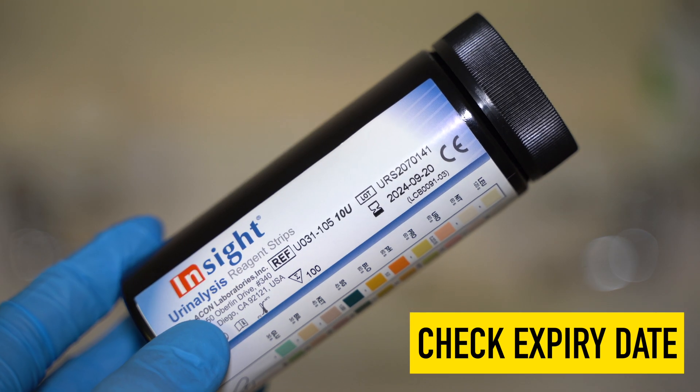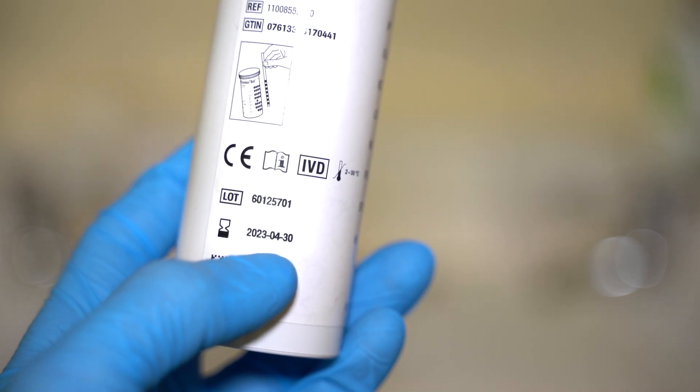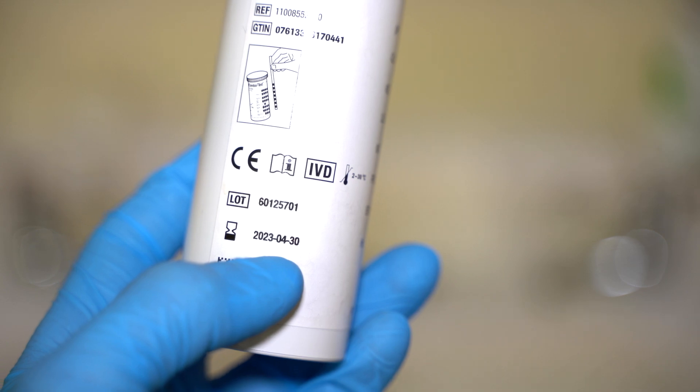We then need to get our urine dipsticks, and it's very important to check the expiry date on the bottle. Because even in preparing for this video, I did find that one of the rooms had an expired bottle of urine dipsticks, which were swiftly binned. It's very important when it comes to your urine dipsticks that you're aware of how long each reagent strip will take to work.